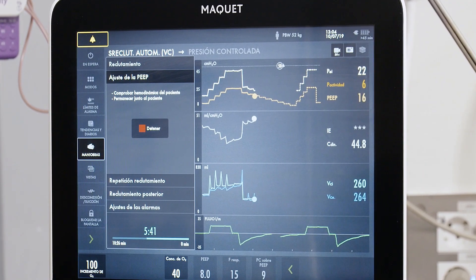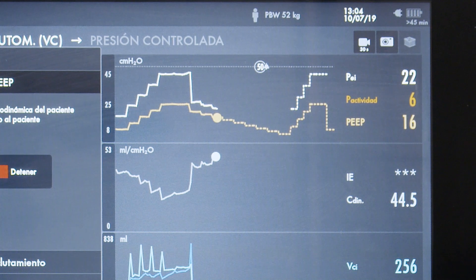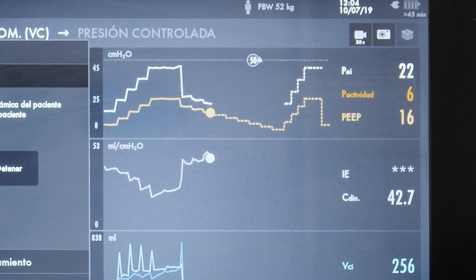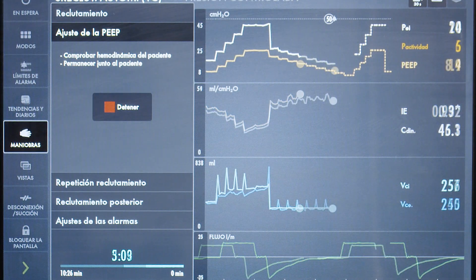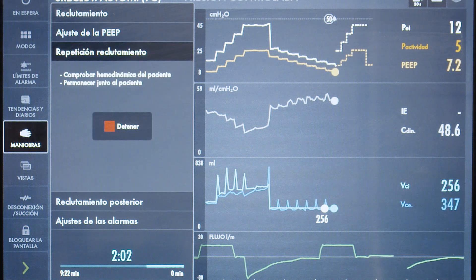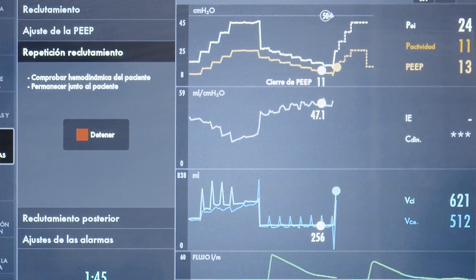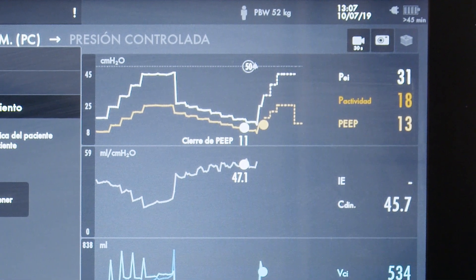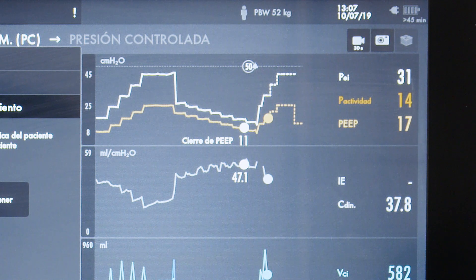As we sequentially reduce PEEP, compliance is increasing — we are relieving overdistension with each reduction in pressure, searching for the maximum compliance that indicates the onset of collapse in the most dependent lung regions. The compliance has now started to decrease, and the system has identified the maximum compliance at a value of 47, corresponding to a PEEP level of 11. The system now performs a second recruitment maneuver with a stepwise increase in pressure, slightly shorter than the first.